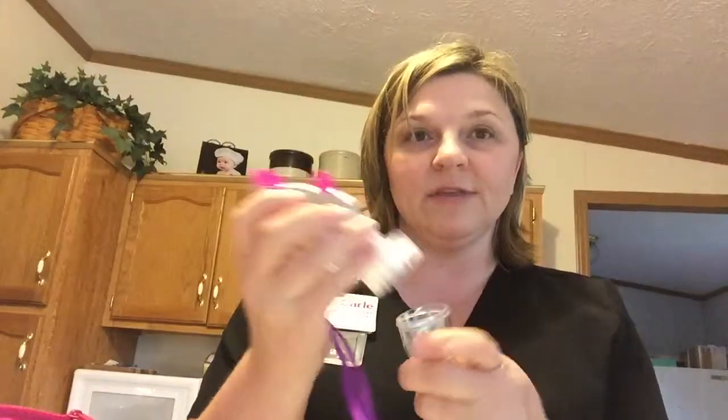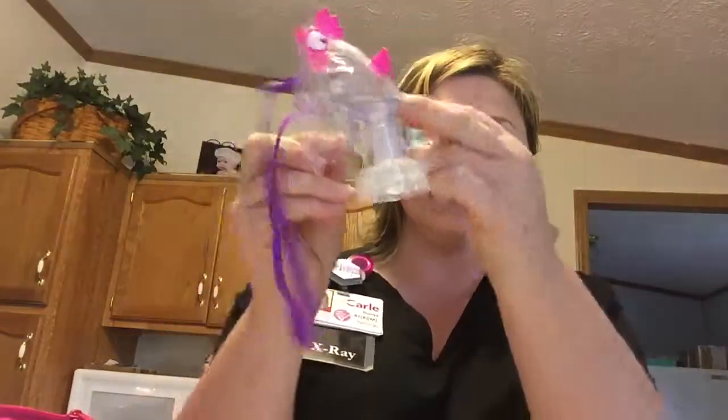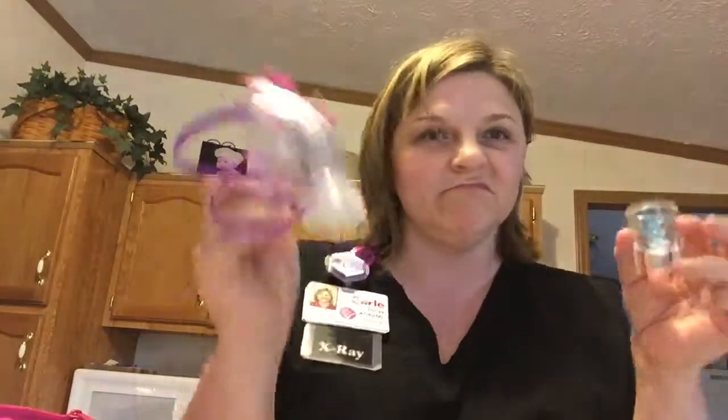Afterwards, turn it off and take everything apart. You just need to wash the medicine cup and mask piece with some soapy water and let it air dry. I've also been running water through her mask and down the tubing. Then it's ready to go for the next time — hope that helps!